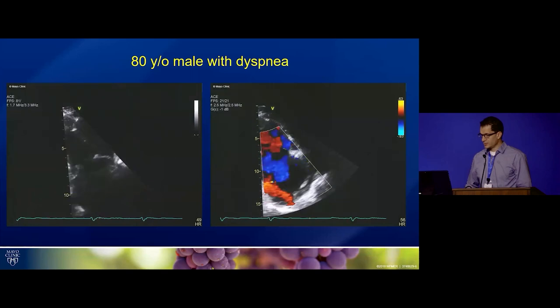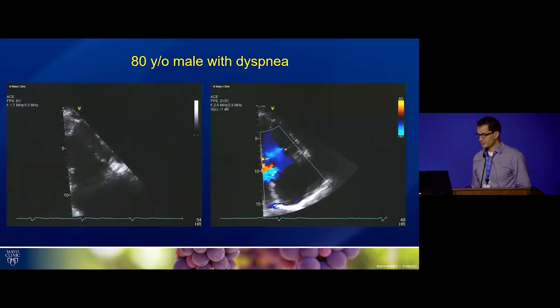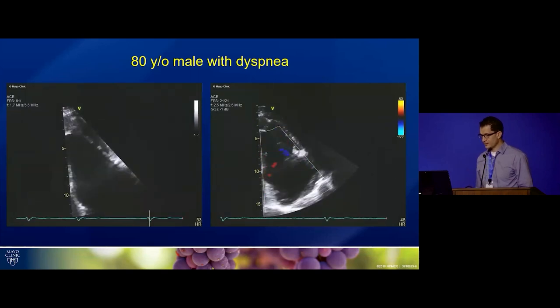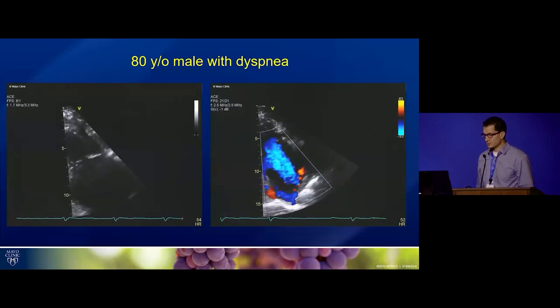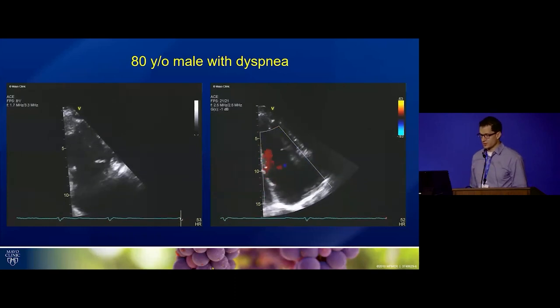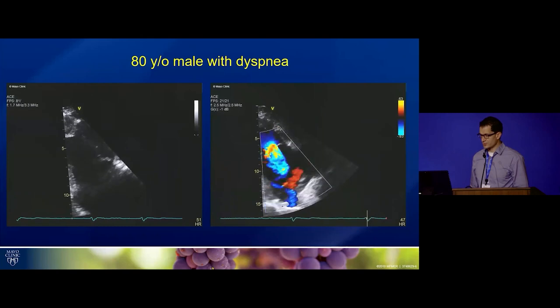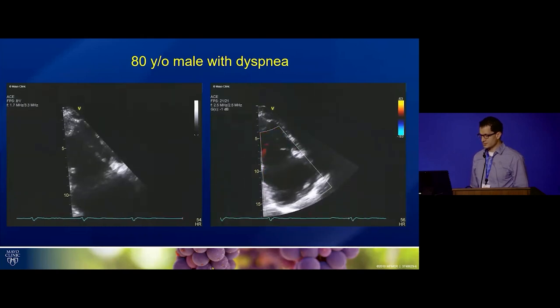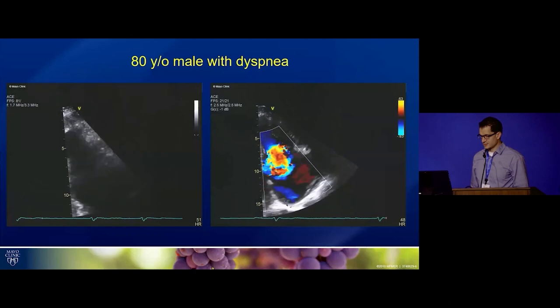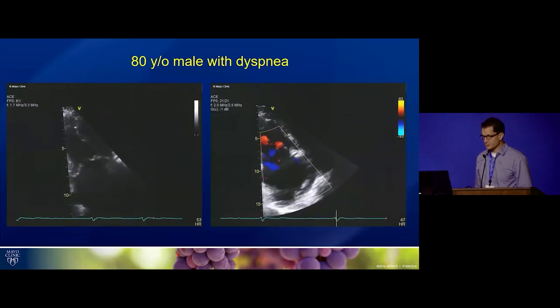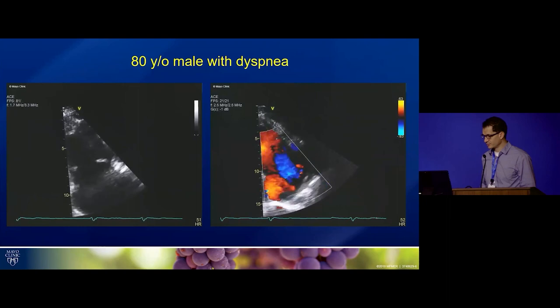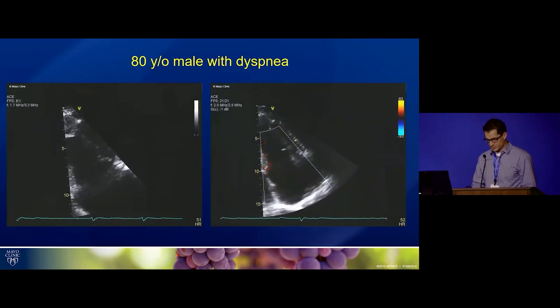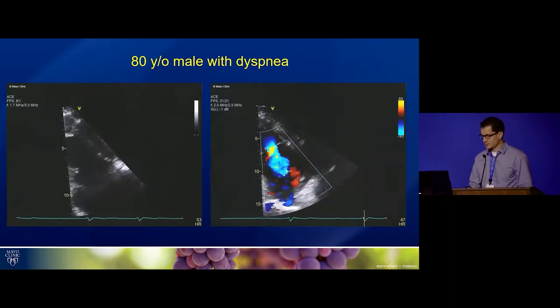Here are the initial images from the echocardiogram — the mitral tricuspid RV inflow view. Pay attention to the leaflets and where they're meeting or not meeting, and you see a very broad jet of tricuspid regurgitation on the right.